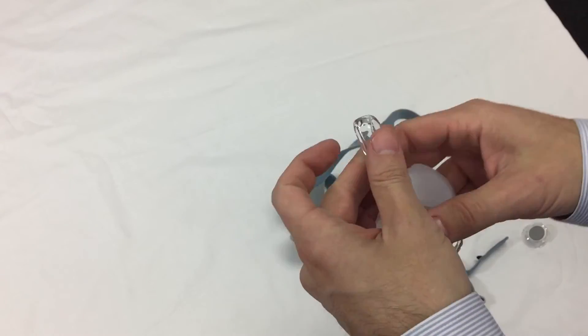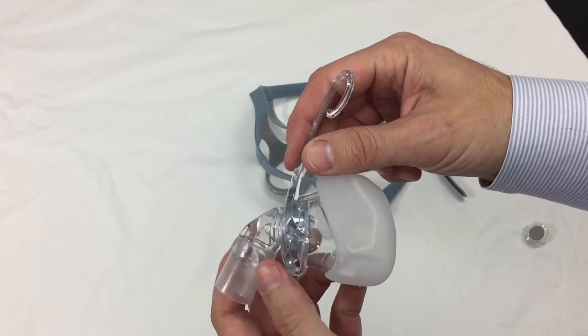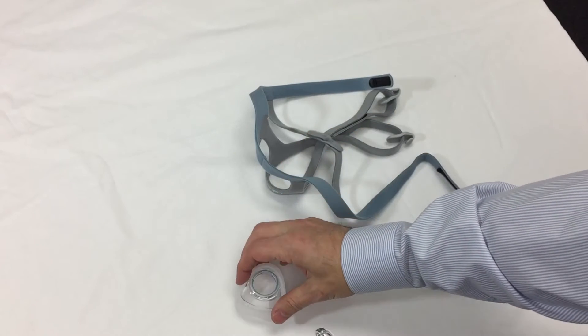So we'll take the headgear off for a second. So you can see there's very few parts to this mask. You have the headgear, the mask frame, the cushion, and the filter.